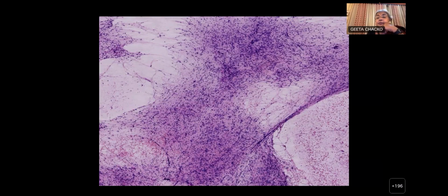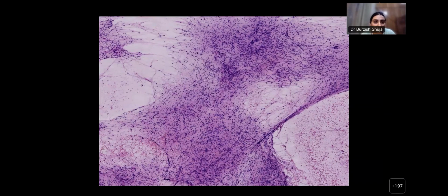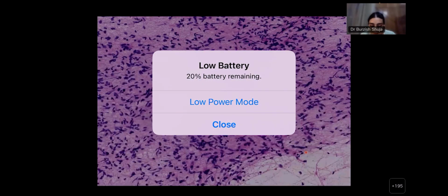Okay. Thank you. So it was a highly vascular tumor at surgery, and this is the smear preparation. It's a hypercellular smear revealing sheets of cells without any particular arrangement, having fibrillary processes. In the first image, there was focal necrosis on one side. We could see necrosis. Okay. Yes, ma'am. And in the higher image of this squash, individual cells are spindled with elongated hyperchromatic nuclei, with many thin vessels traversing through these cells. Okay, and in a fibrillary background.